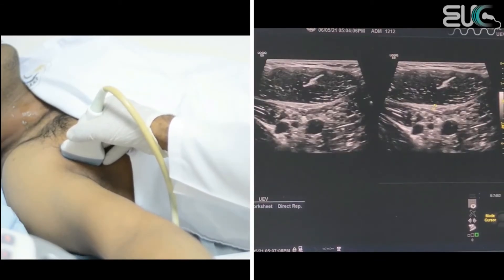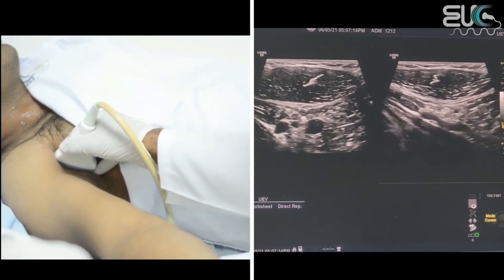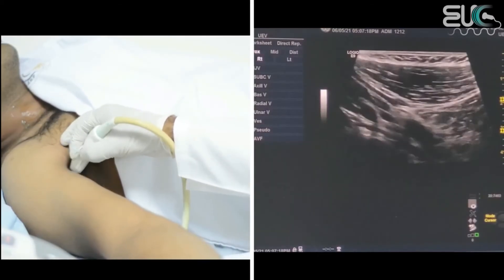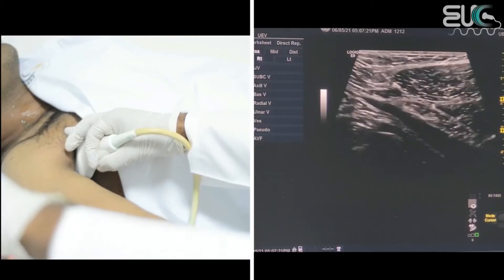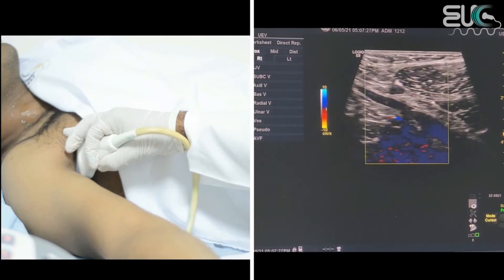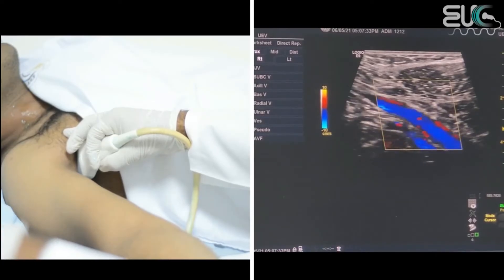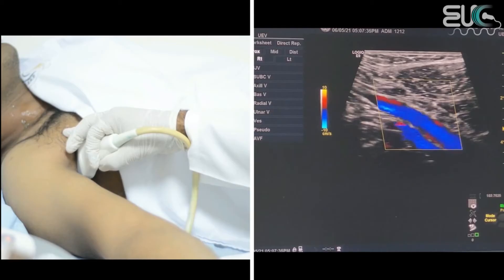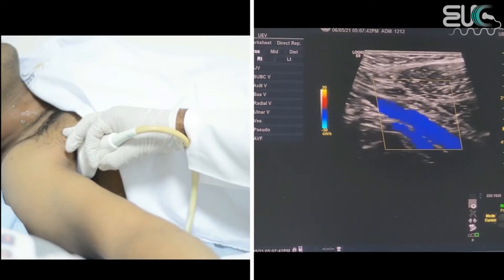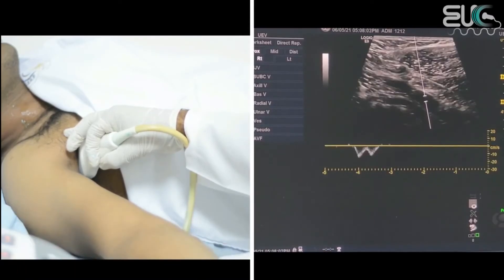First I will check the compressibility — when I compress, it is totally compressible. I will scan it under longitudinal view and then apply the color box. I will reduce the gain to reduce the noise and increase the scale. As you can see, we have reduced the noise. Now I will check the pulse wave without color, and we have a nice waveform.